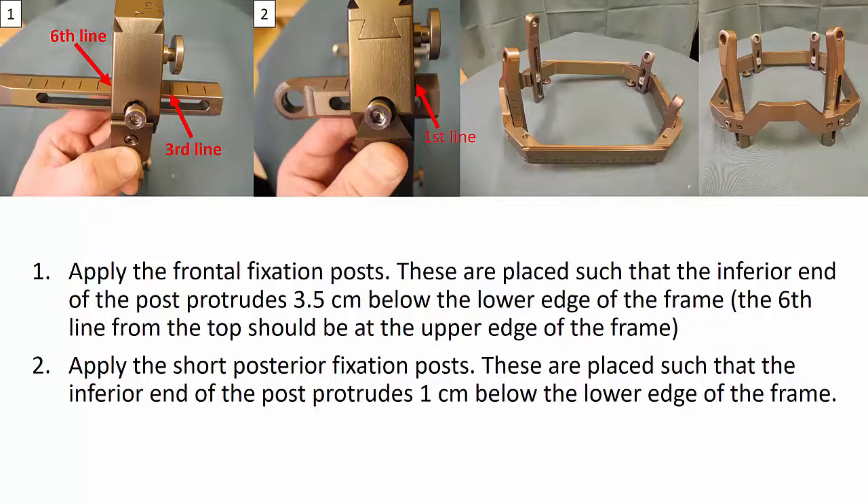The sixth line from the top should be at the upper edge of the frame. Then apply the short posterior fixation posts. These are placed such that the inferior end of the post protrudes one centimeter below the lower edge of the frame.